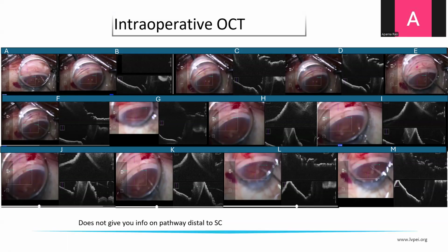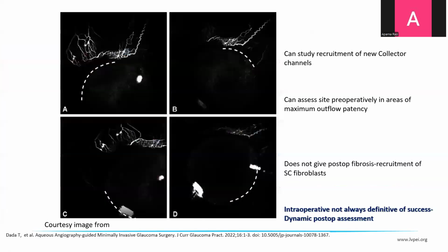However, it's a very challenging procedure to keep focus on one region during the entire operation or the steps of the surgery, since it requires constant focusing by an experienced technician to show the effects at each area as the surgery proceeds through every step.